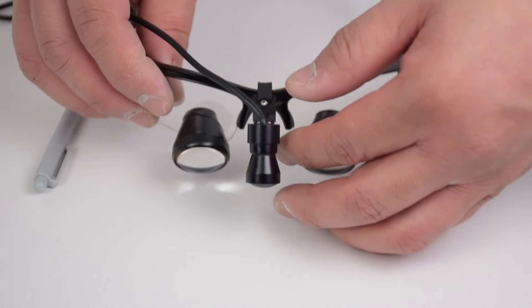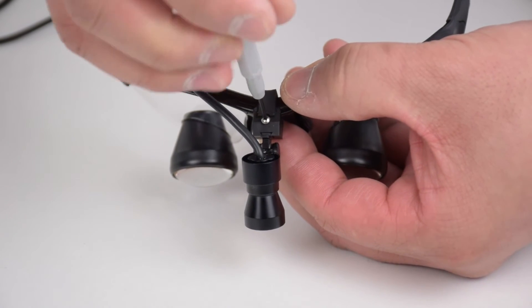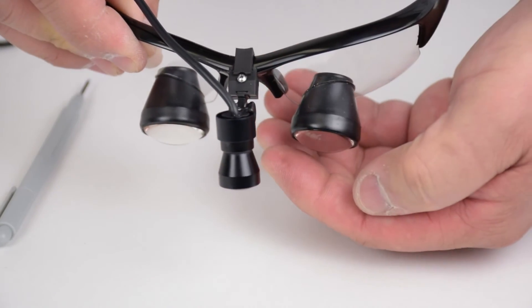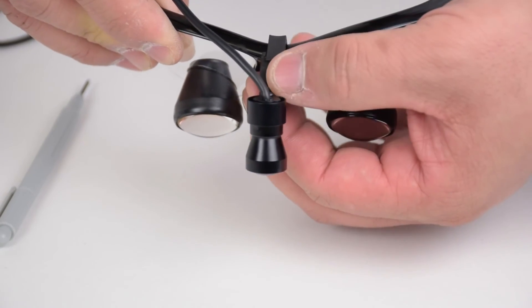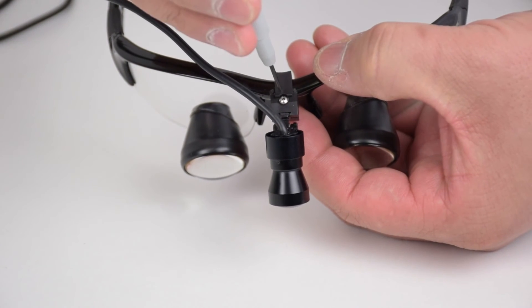First, loosen your adapter using the required tool. Next, move your adapter horizontally to correct your headlight misalignment. Finally, tighten your adapter.